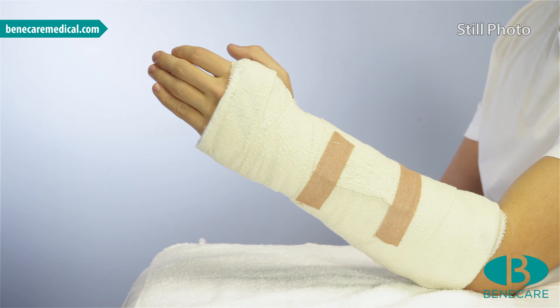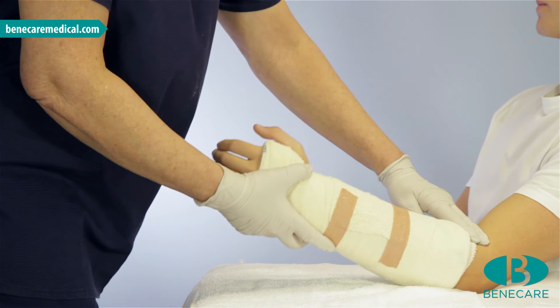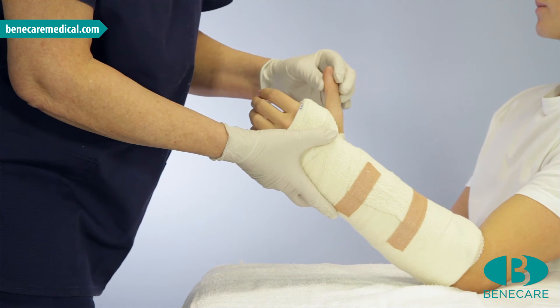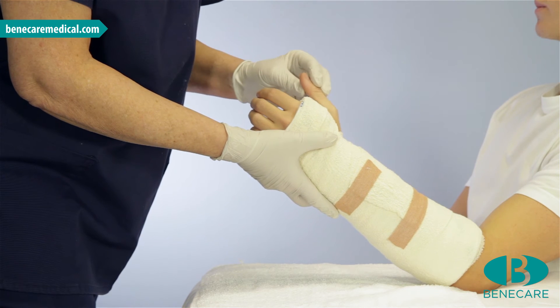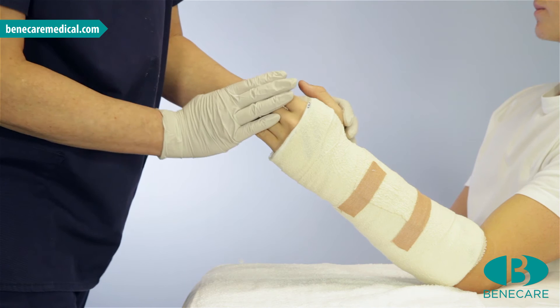The setting time for this product is 4-7 minutes with functional strength achieved in 30 minutes. Check the splint on the limb. It should fit two fingers from the antecubital fossa at the elbow to the carpometacarpal joint on the base of the thumb, and the distal aspect at the metacarpal necks.